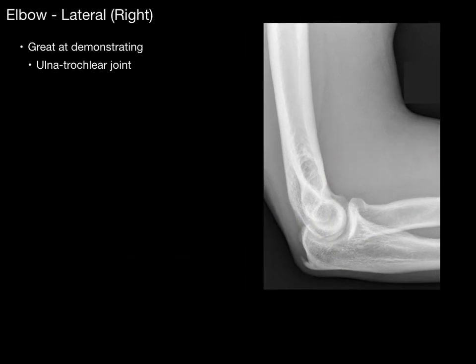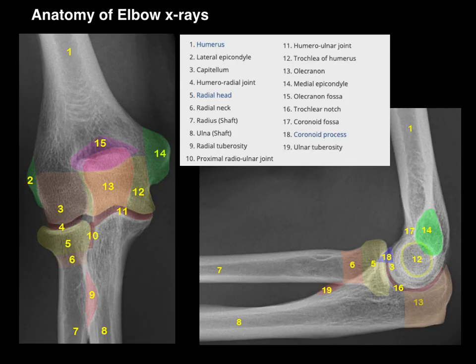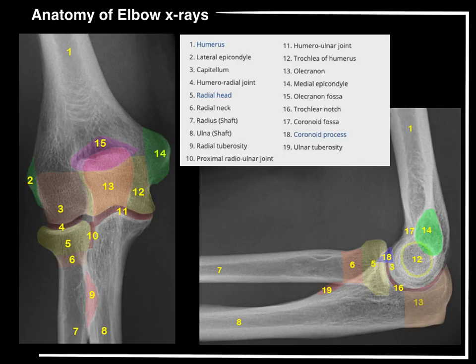This lateral view of the elbow is really great at demonstrating the ulnar trochlear joint and the coronoid and olecranon processes, as well as the anterior humeral and radiocapitellar lines. And that, my friends, is the anatomy of elbow x-rays in a nutshell.